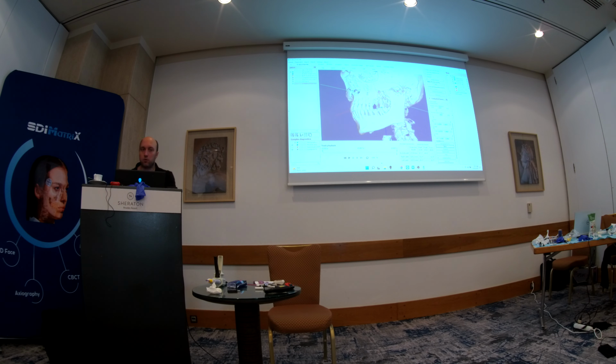The next points are the condyle points. Condyle points are placed on the tip of the condyle in order to see the joint more clearly.